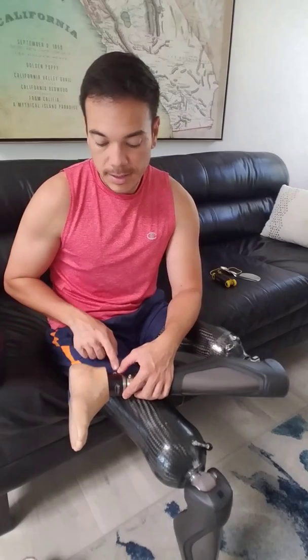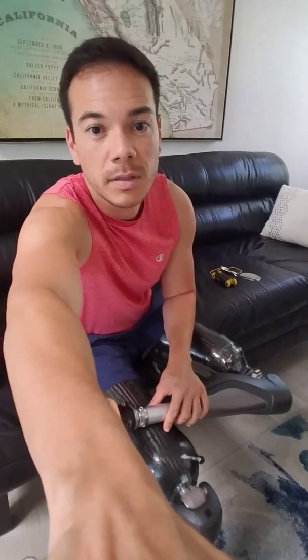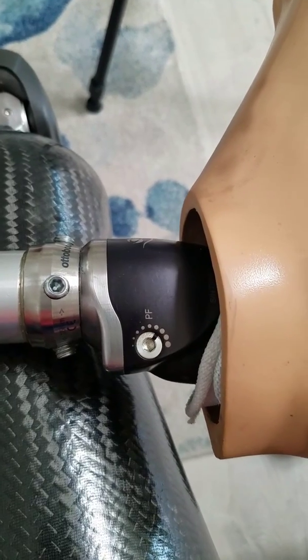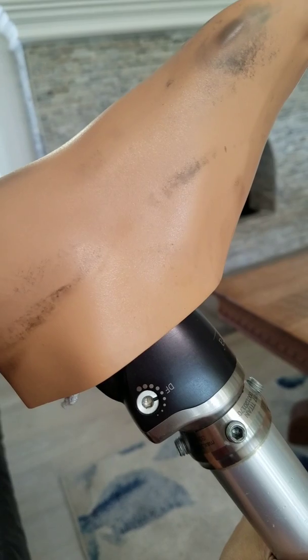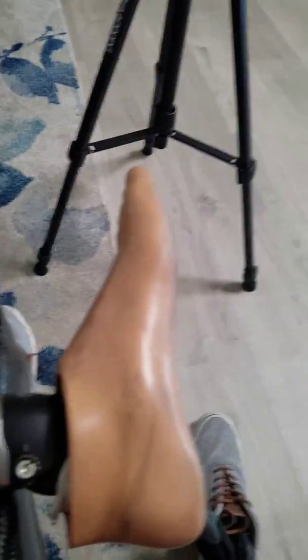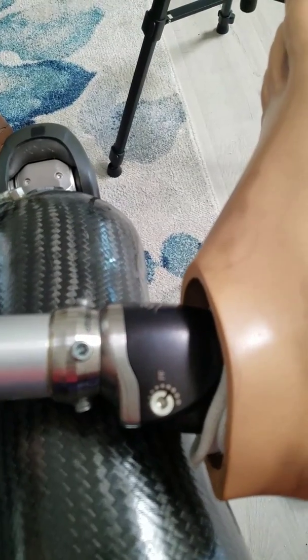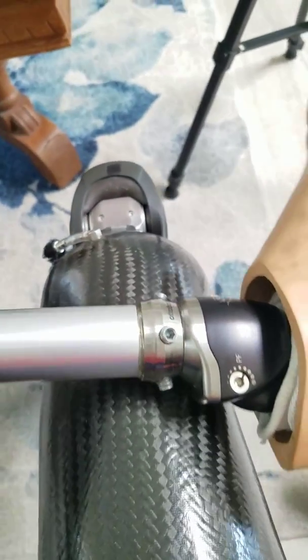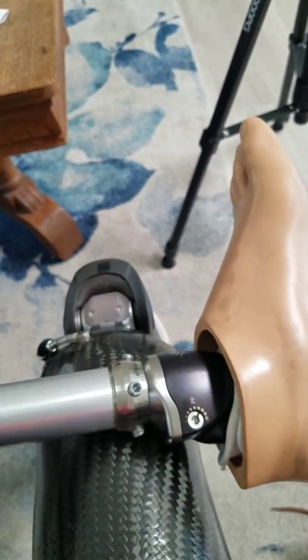On the feet there are settings for the plantar flexion and dorsiflexion — you can adjust the resistance, which I'll show in just a moment. Let me zoom in here. There's the adjustment for plantar flexion labeled PF, and on this side is the adjustment for dorsiflexion. I can adjust the resistance depending on what I'd like, and a lot of it is trial and error. My prosthetist told me to move them a half turn, and you can do that using one of these — which most amputees have — and it's pretty easy to turn.